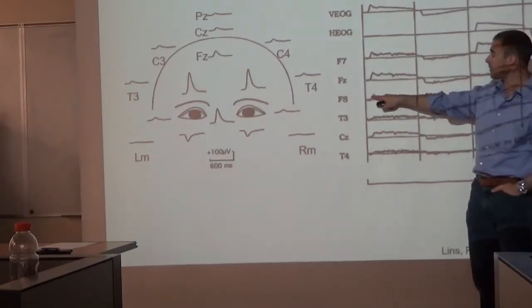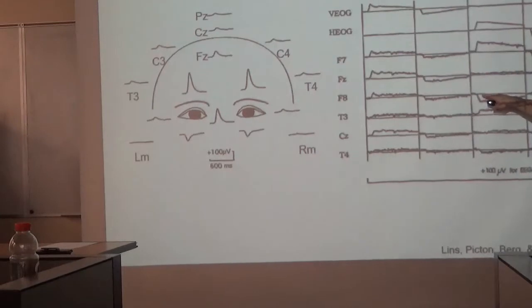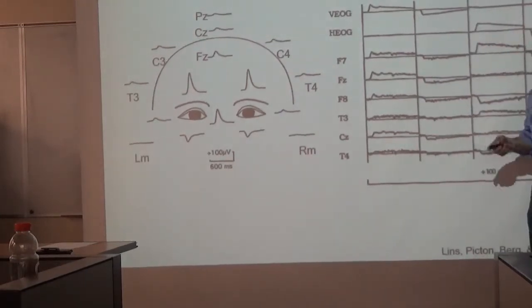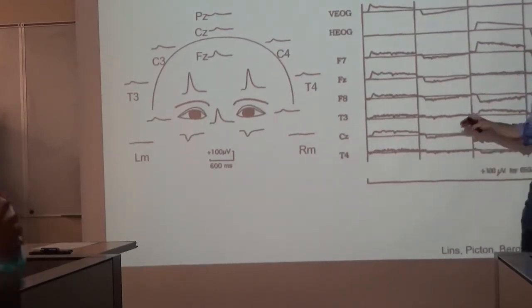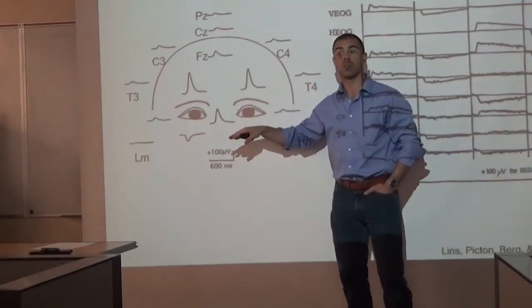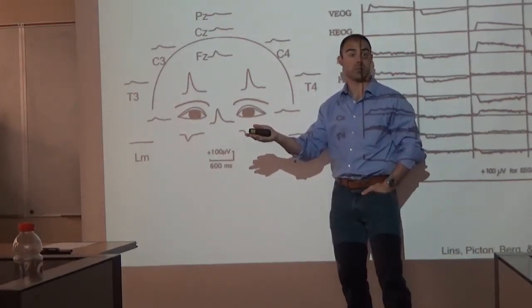But really it's a vertical ocular movement, or a horizontal one, that we can know based upon that trace. That's really useful, because then we can correct or subtract it. But if we let these artifacts slip into the data we end up using, then you guys can hopefully appreciate the contamination of the data, right?